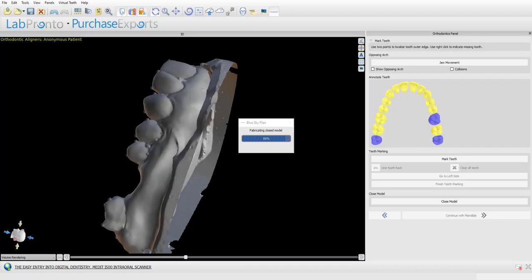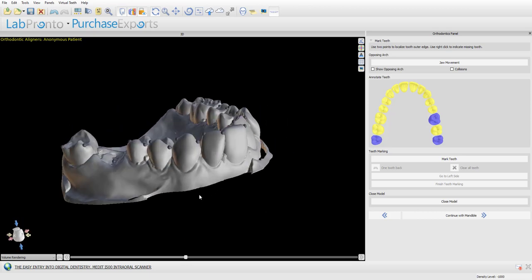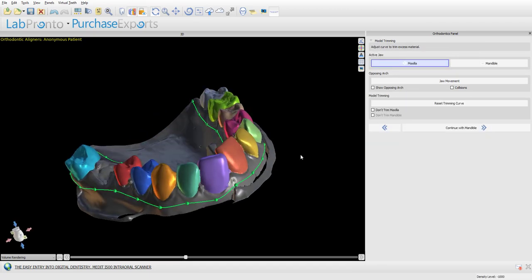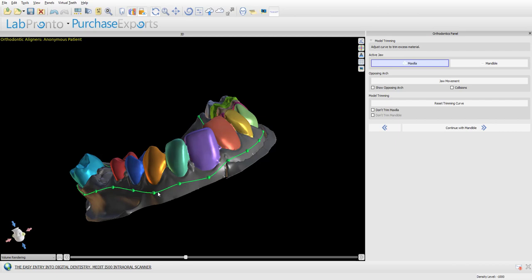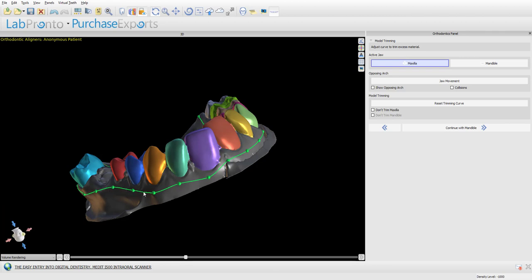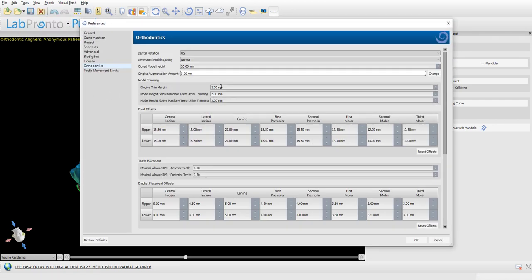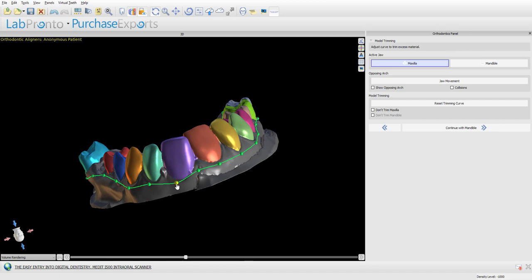Switching back to our software case, we can see the model has been closed and measures a solid 20 millimeters. After placing two dots on each tooth, the software runs automatic segmentation and we get our segmented teeth. In the trim model step, the software places a trim curve according to the gingiva trim margin setting, which by default is set to two millimeters below the gingiva margin. If we change that setting and click Reset Trimming Curve, we can see the software move the trim curve closer to or farther from the gingiva margin.